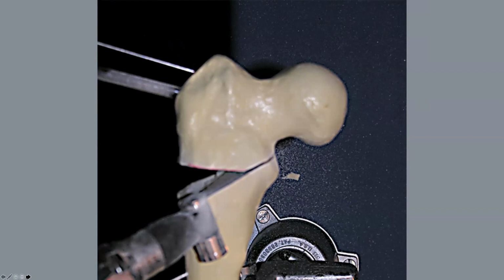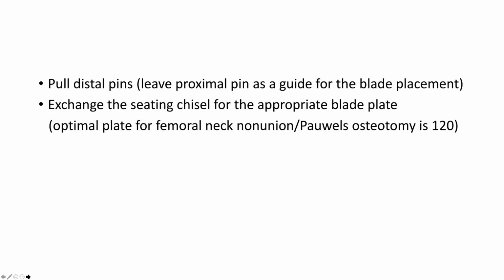So it gives you an idea of depth, and it's a little bit fan shaped. But a smaller, thinner blade generates a lot less heat, takes away a lot less bone, and actually is a much more precise instrument. So that I would strongly recommend.